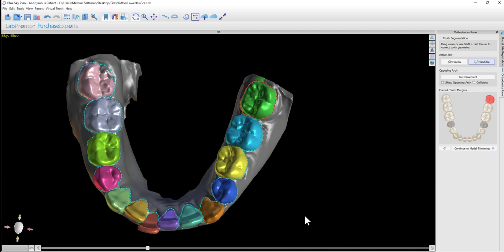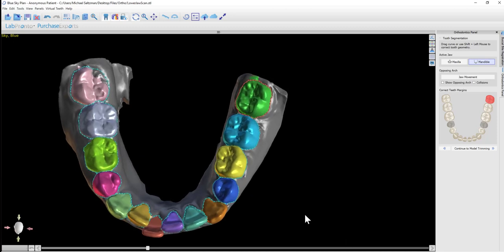We've segmented the teeth and now we're continuing to model trimming. I'm left-clicking on continue to model trimming.